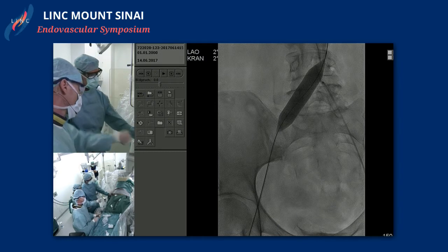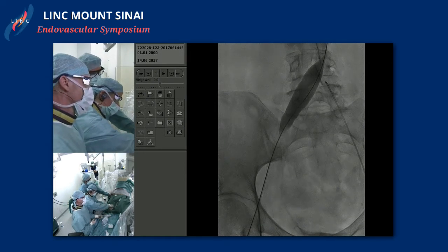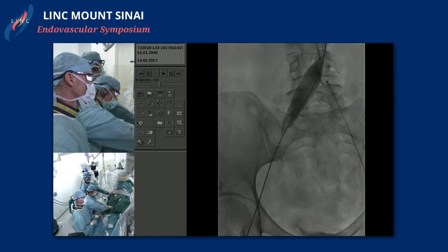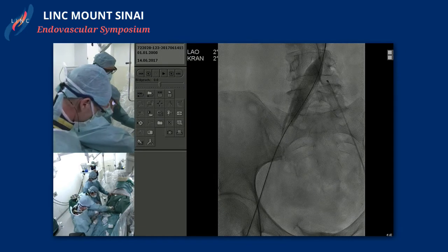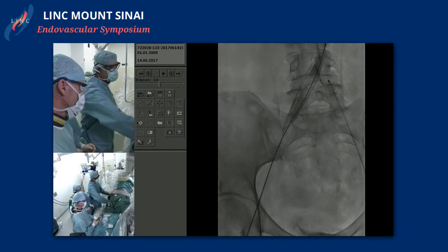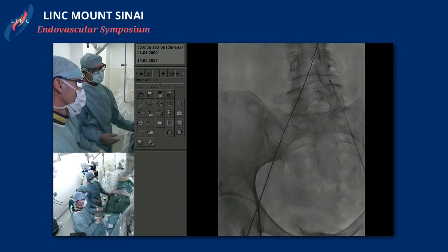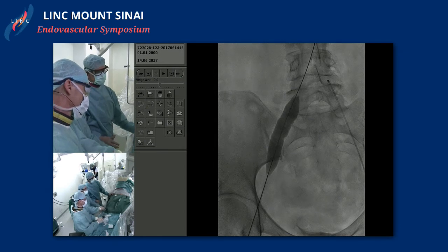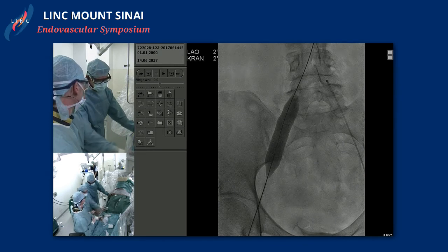I guess, Andre, I personally don't routinely place large diameter balloons before I place a stent. In certain instances where it's a complete occlusion, I'll pre-dilate just to facilitate the introduction of the stent. But I usually use large diameter balloons to post-dilate the stent and make sure there's uniform wall apposition. So I think that's a little bit of a unique technique. I'm curious, Anil or Paul or Windsor, whether you usually pre-dilate to large atmospheres before you place a stent here.